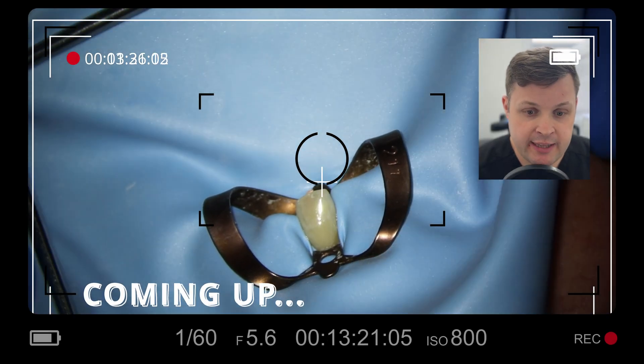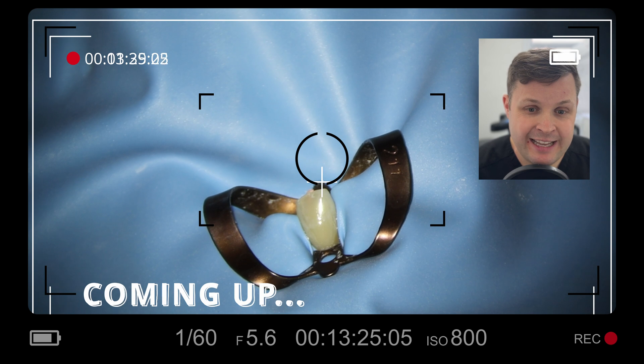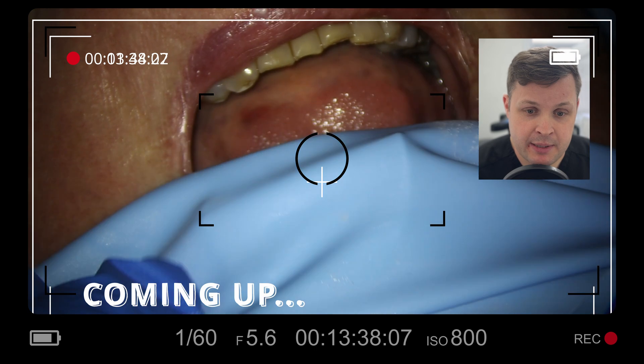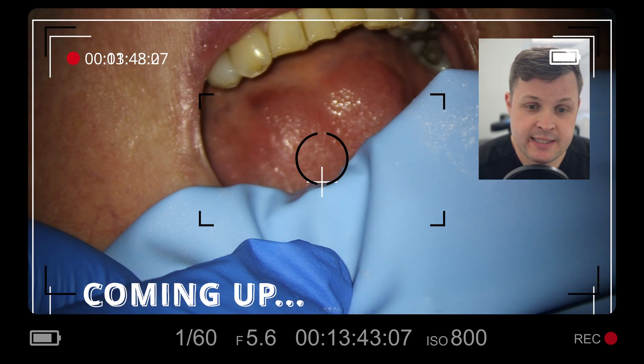I'm going to very gently fold the rubber dam in on itself so the patient can still breathe. I'm just going to check to see where the rubber dam clamp is. I'm going to get the patient to open really nice and wide and not to close until I say so.